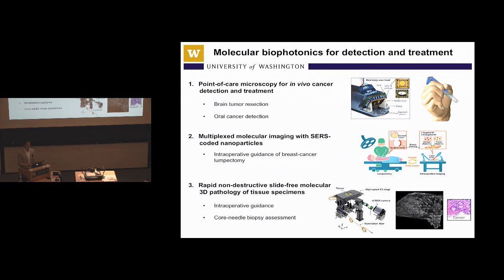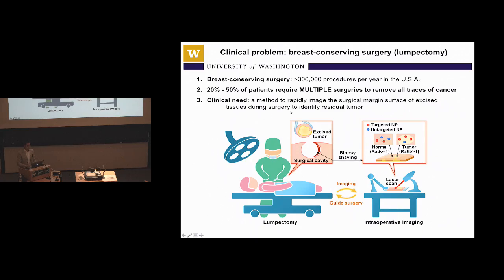Most of them are normal and benign. But a few of them, if they are cancer, you want to catch them at the earliest stage where they're treatable. So if we had a handheld, non-invasive device, where you don't have to take out tissues from the mouth, and we can place that into the oral cavity and inspect these lesions, it may be a way to catch these cancers much earlier before they progress.